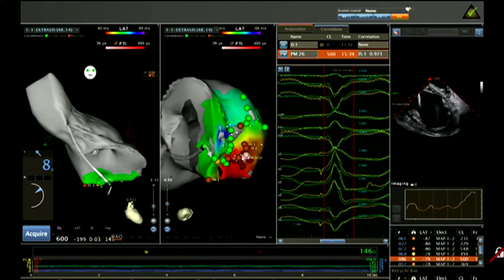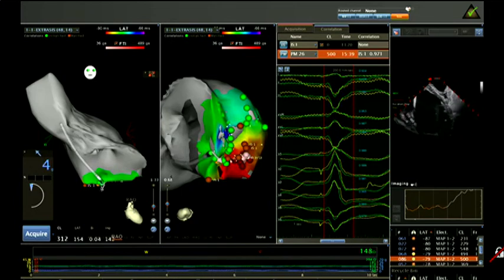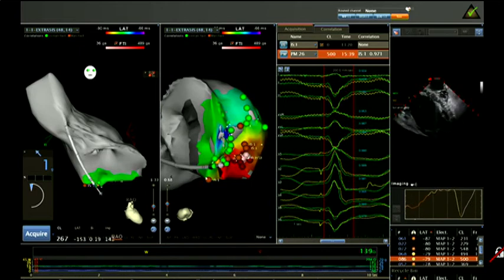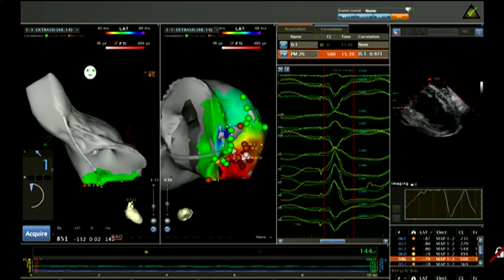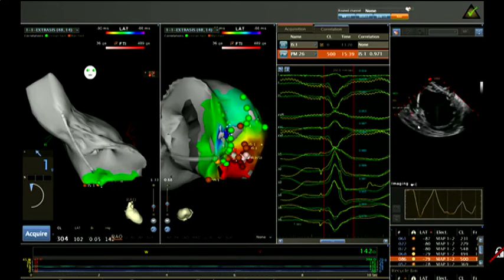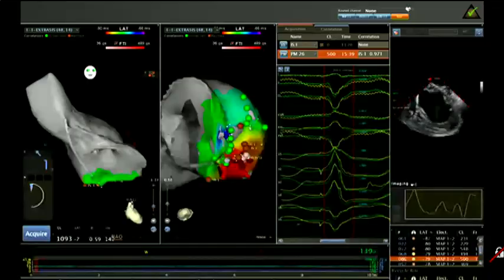As Miguel was saying, something very important in this case, and any other case of extrasystole, we have to be absolutely sure that the sites of activation are really spontaneous of the patient and not mechanical induction due to excitability, particularly in the bundle close to the base of the papillary muscle.